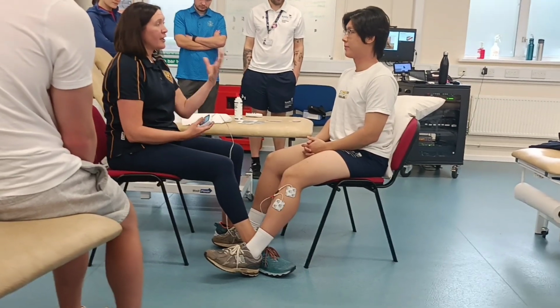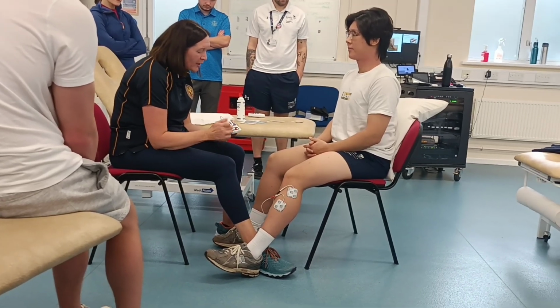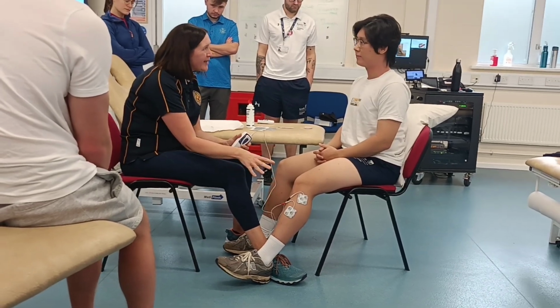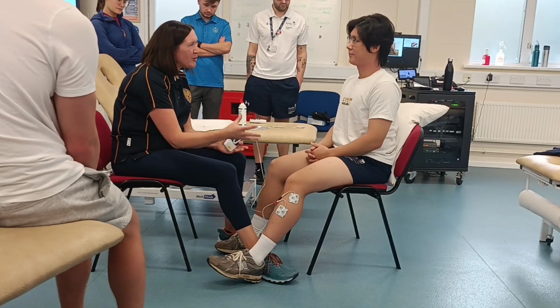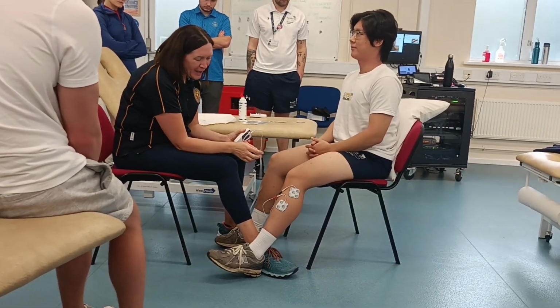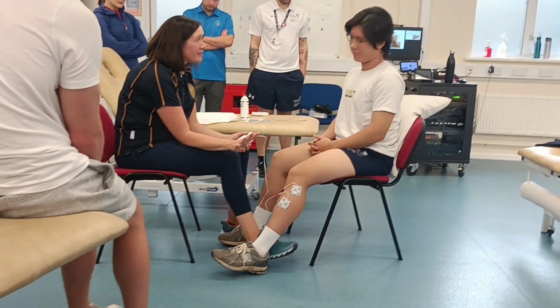Just watching, I would always say to my patient that I'm using just a normal battery just to deliver a small electrical current to the muscle and nerve in your leg. They're not working properly at the moment because of either the damage in the brain or the spinal cord, whatever's appropriate. And we're looking just to stimulate that muscle and nerve to get your foot to pick up and out to the side.